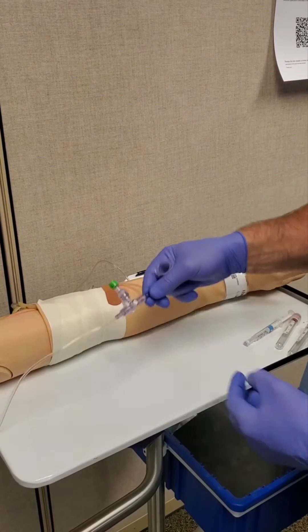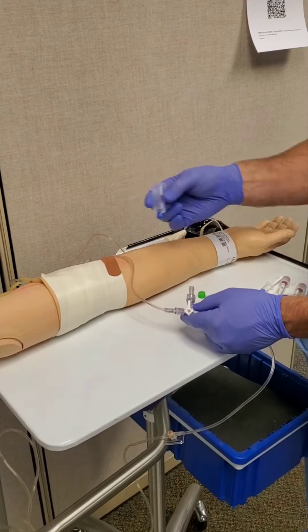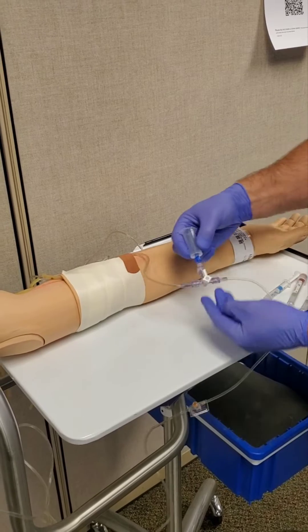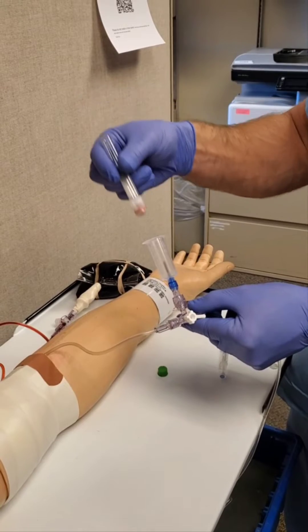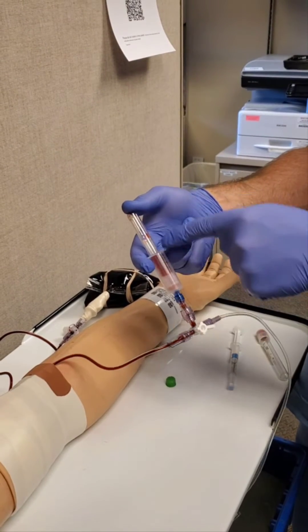Find your A-line on your patient and remove the green cap on the stopcock. Place the vacuum container on the port and open the stopcock to the patient. Put the waste tube in the vacutainer and allow it to fill completely with blood.